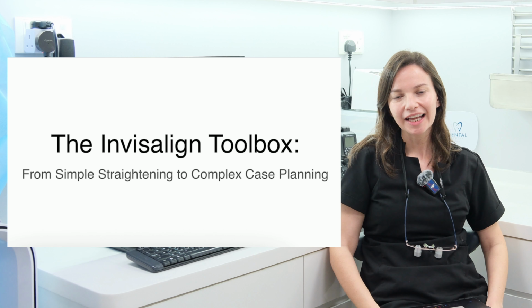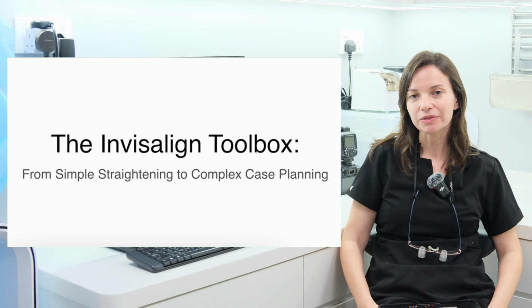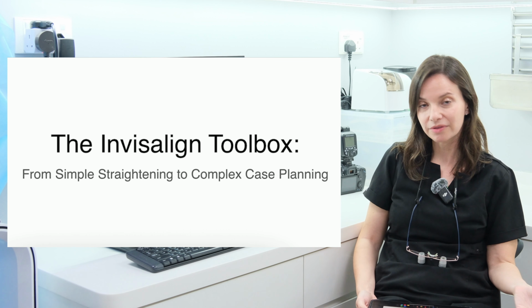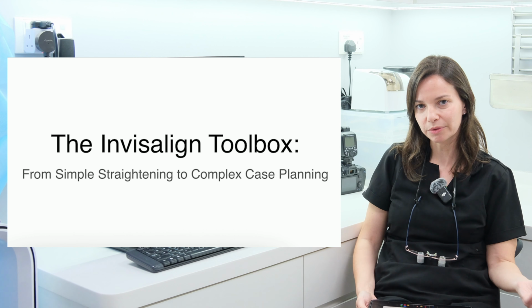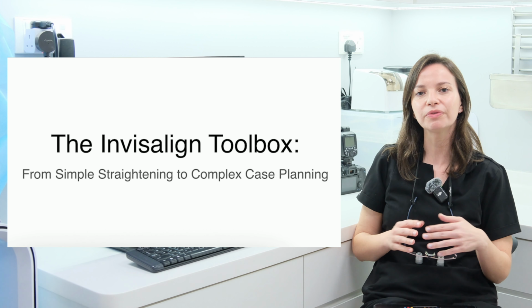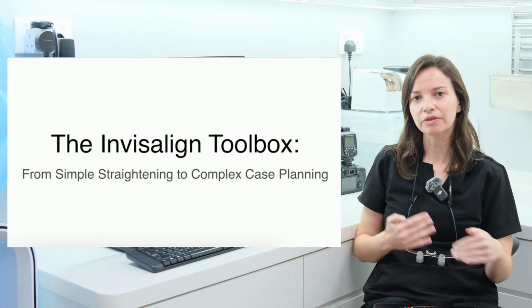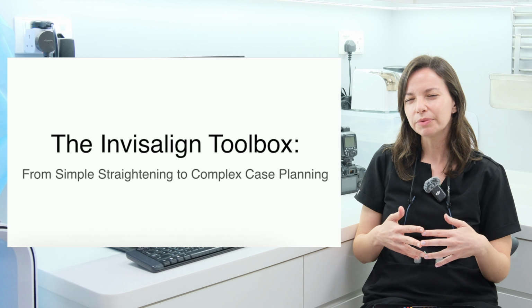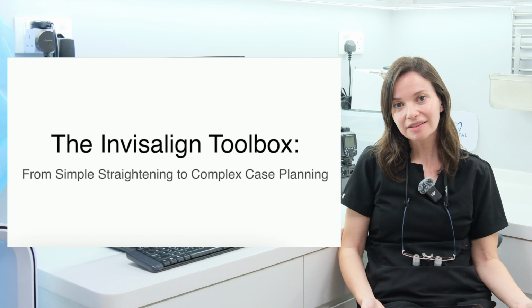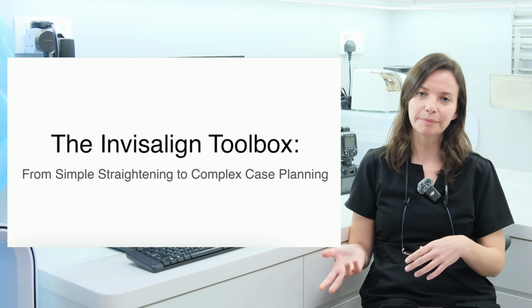My name is Maria, and I'm going to talk a little bit about what you can use Invisalign for in a patient's treatment. Invisalign can be used for simple cases, including just normal crowding or relapse after braces. It can also be used to plan for more complex cases before a restorative treatment. So if you're thinking about getting veneers or crowns and the teeth are not lined up, you won't usually get the best aesthetic result. I'm going to show you a few cases where Invisalign can be simple and a few where it can be used to set up for more complex treatment.